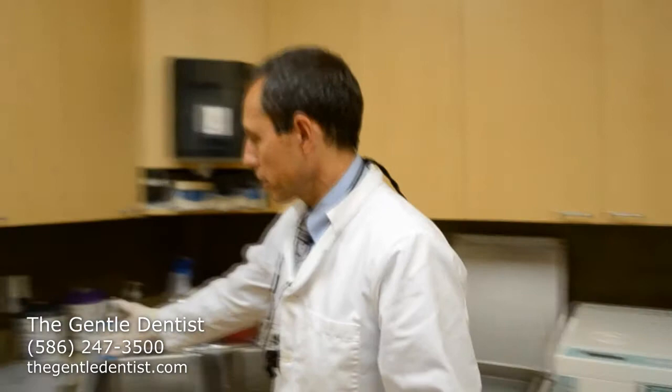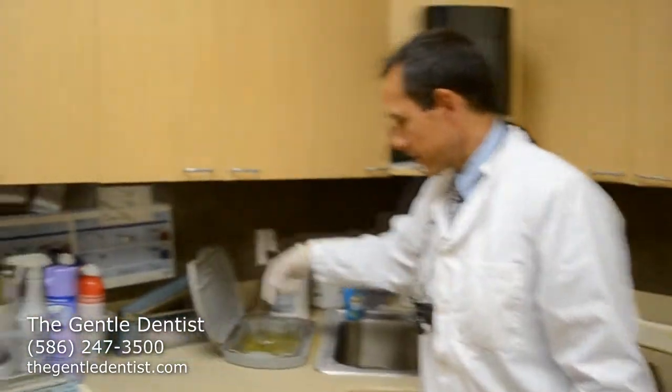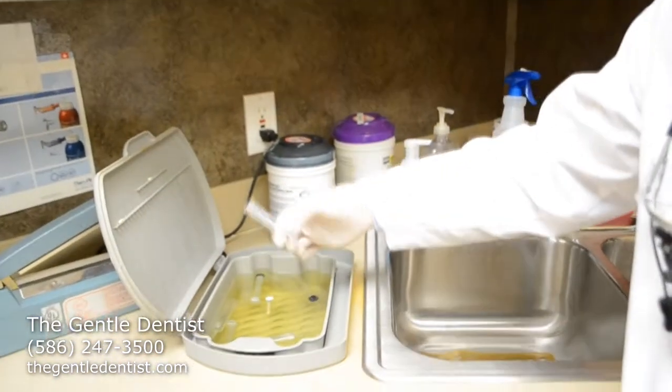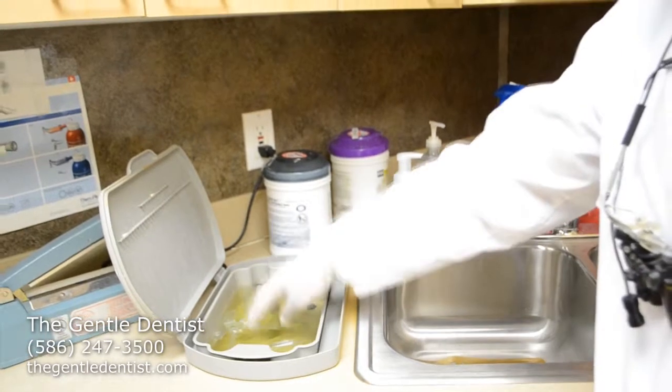We also sterilize our dental handpieces, the drills that go inside your mouth. Now, anything that is not metal that cannot be sterilized we'll actually dispose of. The things that we cannot dispose of, we'll put here in what's called our cold soak. For example, there are some syringes in here. This is a liquid that, when it sits over about a 10-hour period of time, sterilizes, not just decontaminates, the plastics that are there. Very few things that we use need to do this. Most of the things we use, like I said, we throw away or we autoclave.